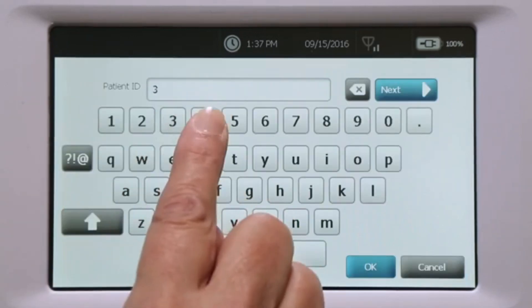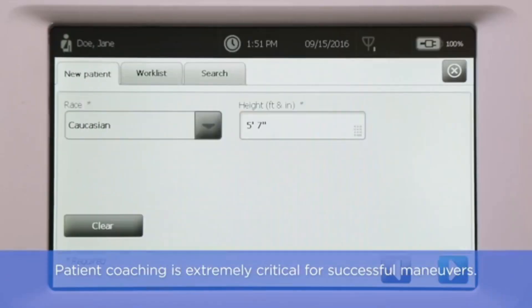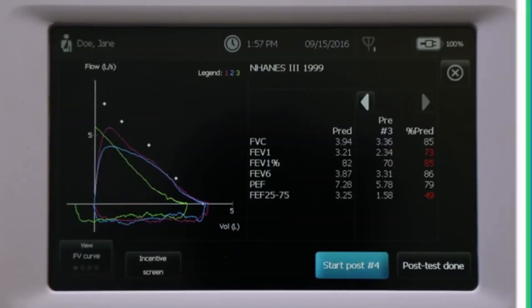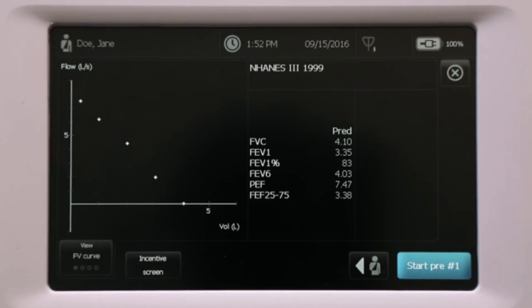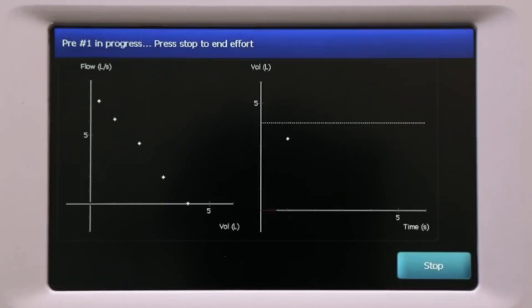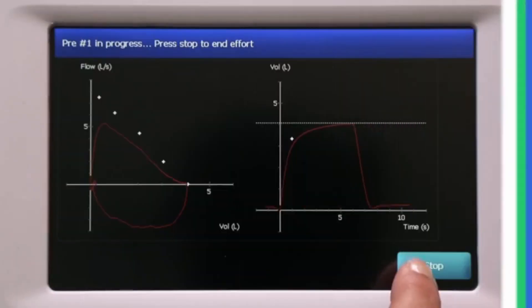After accepting the calibration, touch the Forced Vital Capacity button, which will prompt you to enter patient information and demographics. At this point, the patient should be ready to perform the maneuver. You can choose to view an incentive screen, flow volume, or other curves during execution of the maneuver.